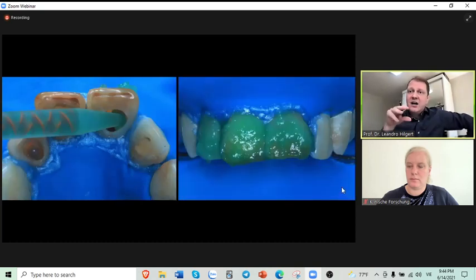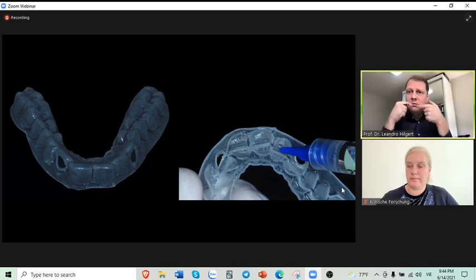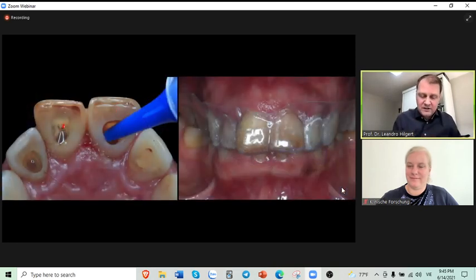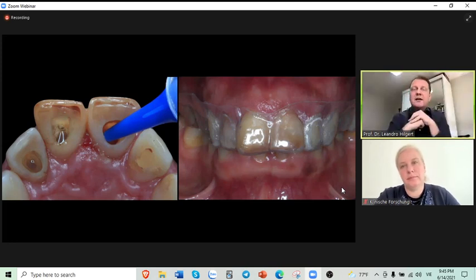Here we're doing an in-office session, the first session with 35% hydrogen peroxide gel, and we produce for this patient an at-home bleaching tray. And we taught the patient how to apply the gel outside the teeth into the tray, and inside the teeth into the chambers that were maintained open but sealed in the cervical area before. And the patient used an at-home gel for, in this case, 3 weeks.